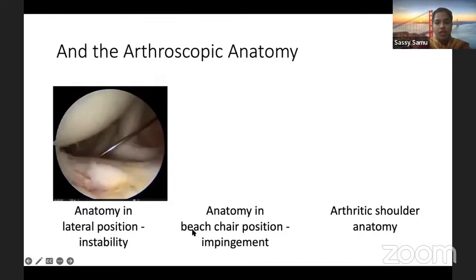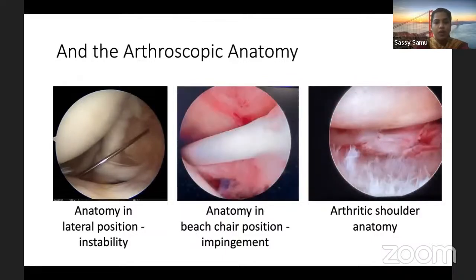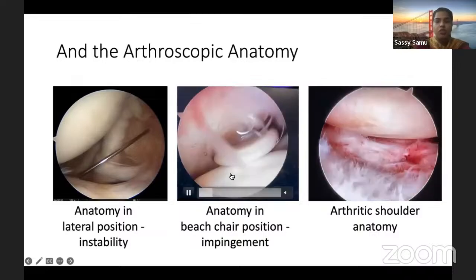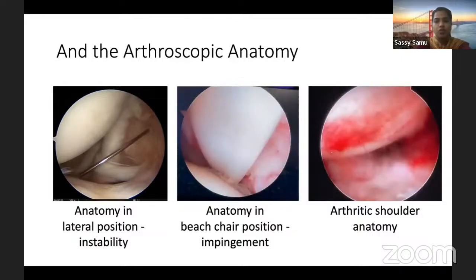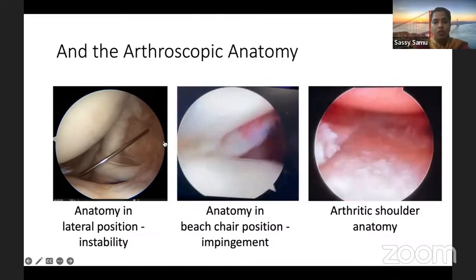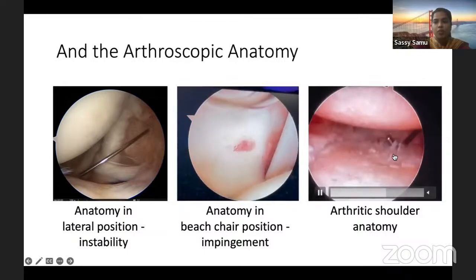Next is anatomy orientation in beach-chair position. Here, the glenoid is facing parallel to the floor, and you can get a better orientation of the rotator cuff by abducting the shoulder, and see the attachment and insertion of the biceps. And you also need to understand each shoulder is different and each patient is different. This is the third case where you get to see an extensive damage, cartilage damage of the shoulder.